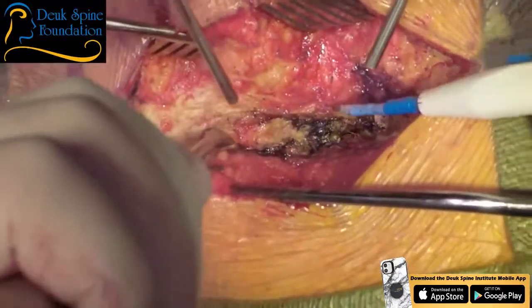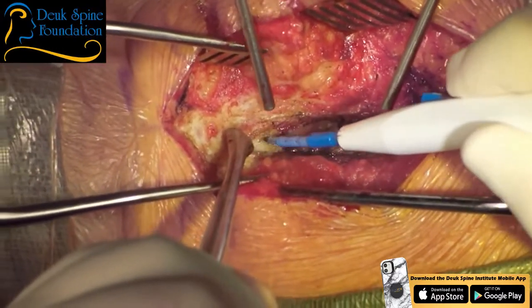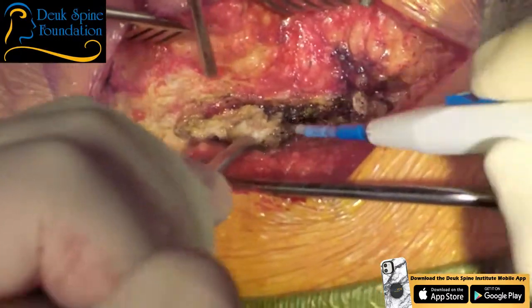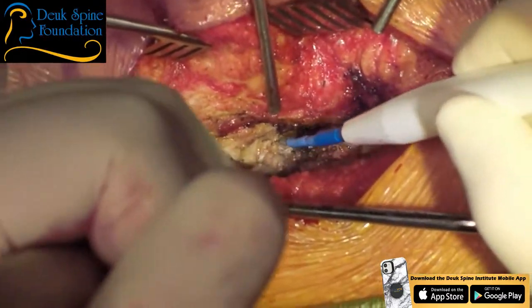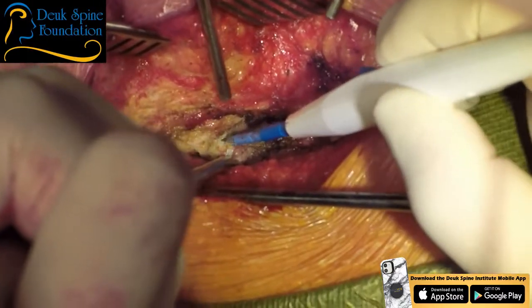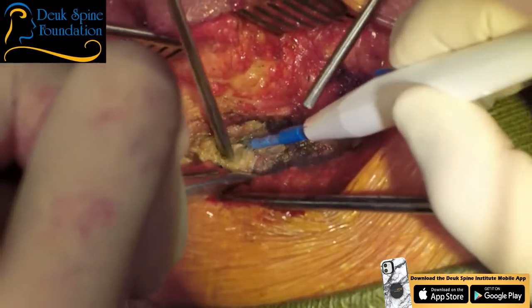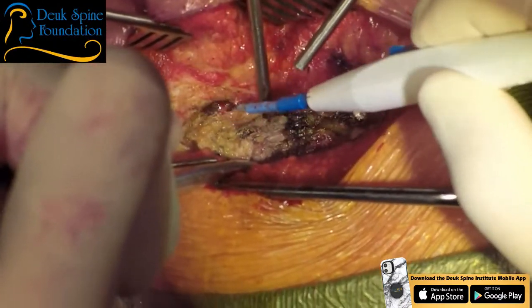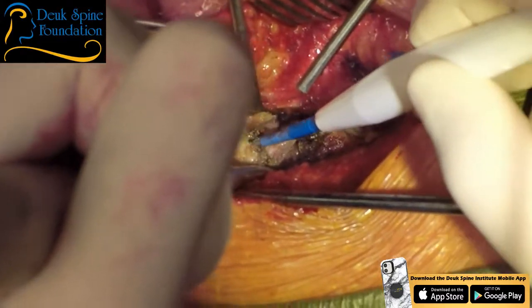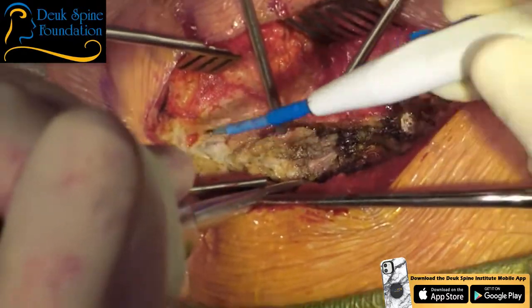You protect the muscles with basically muscle relaxers, which the anesthesiologist gives. We still have a little bit of contraction. All right, we're going deeper and deeper. We knew this would be a deep dive because our patient has the body habitus with a lot of soft tissue. We still have a little too much contraction on the muscle. I'm wondering if we can't do a little more. Now, this patient's never had surgery before.